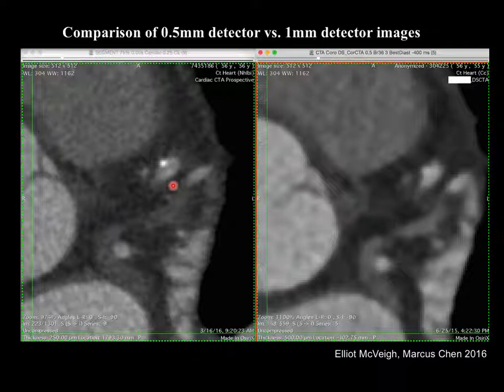I mean, now these pictures get huge. They were big enough, right? One dynamic study is like 2 gigabytes. And now you put this in here, you're talking 8 gigabytes or more, right? 16 gigabytes per study if you do a dynamic study. And so you're really pushing the bounds of what digitally you can do. So any questions about that?